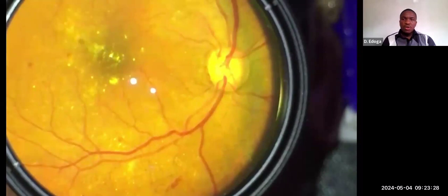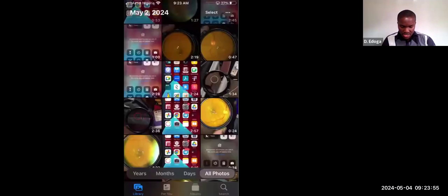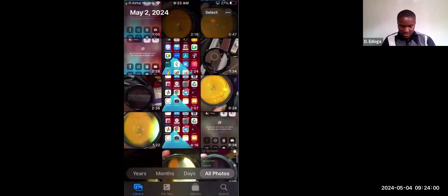It is automatic, and when it is automatic, it is self-regulating, so it will not know what you intend. So it's very important that we use applications that know what we want by the settings that we give it. I'll go back and show how I was struggling to image the retina in this patient.